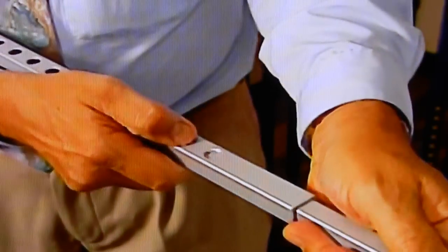Its length can be adjusted with just the push of a button. And by separating the upper part, the Hurricane Crunch becomes an ergonomic cane — two walking aids for the price of one.